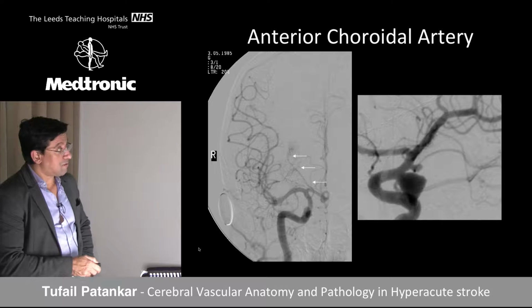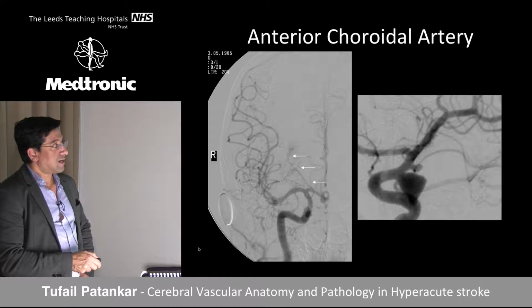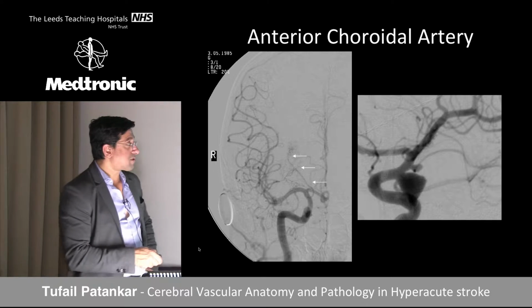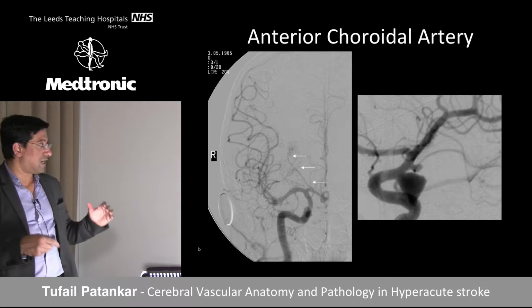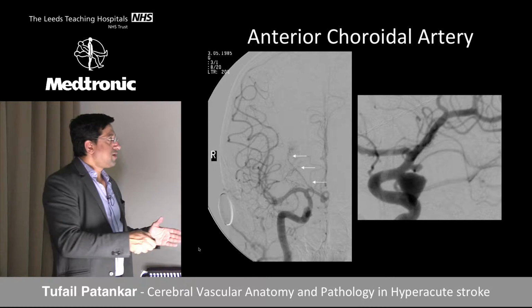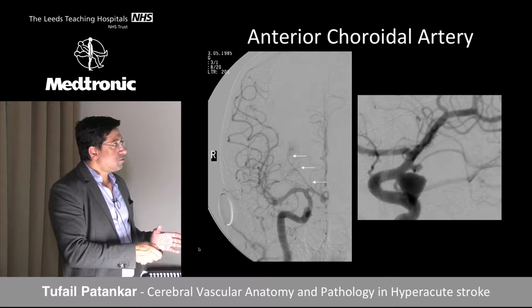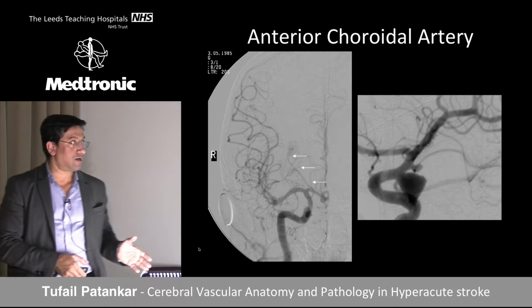Both are important anyway, but you can see that if I treat this aneurysm and I lose this, I may just get away with it, because the PCOM is quite big. Something I've learned over time is that if you are in trouble, look at the PCOM and see whether they're in balance. You need to remember the one branch in the front is the ophthalmic, and two branches in the back, one is the PCOM and one is the anterior choroidal artery.